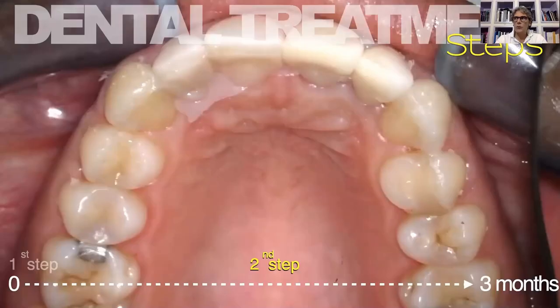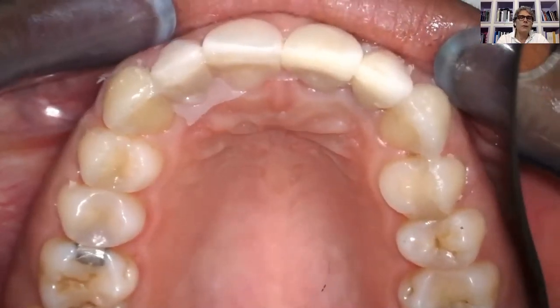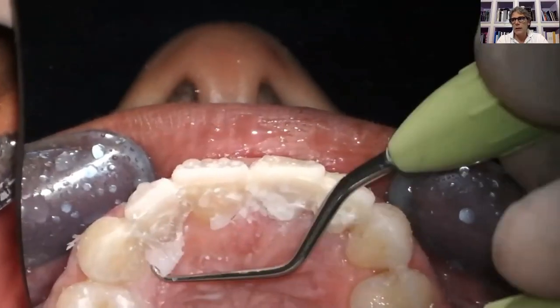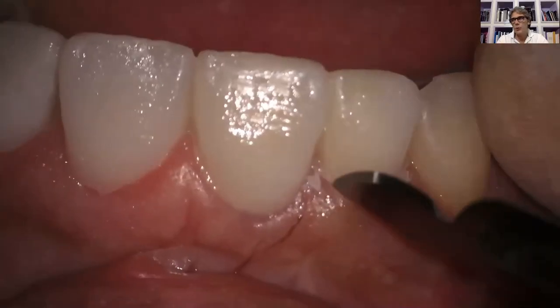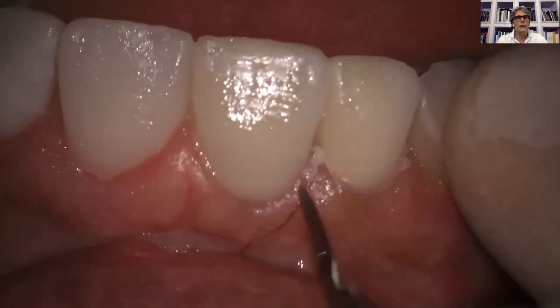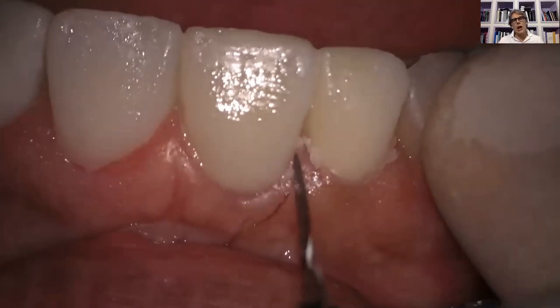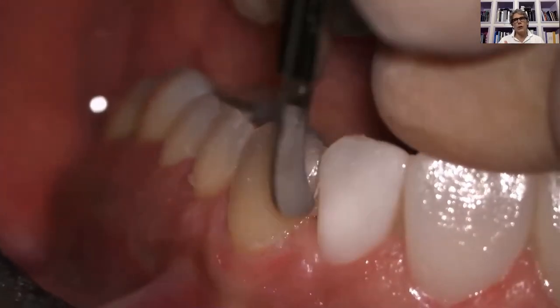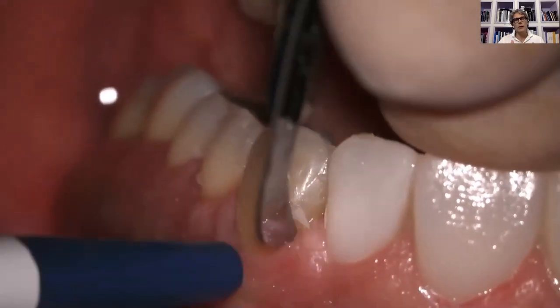The first thing to do, as you can see from this video, is to create the mock-up inside the patient's mouth. And that is fundamental for 2 reasons. The first reason has to do with the fact that as a first thing following the chair side process, I have to copy each anatomical detail of this mock-up, sharing this good anatomy with the software CEREC in order to allow it the possibility to create a new restoration with the same morphology of the mock-up.